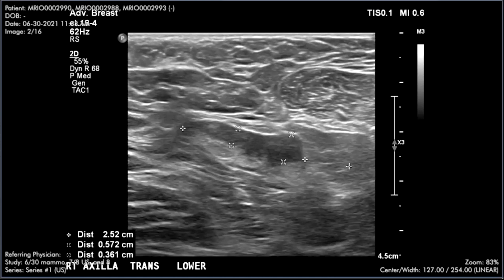We thought because of the timing so close to her COVID vaccine, it was likely reactive, did not resolve at the 12-week follow-up appointment, and biopsy did show CLL. So this is just a good reminder, and this is a new topic and may be evolving, but this is what the current guidelines are recommending that we do.